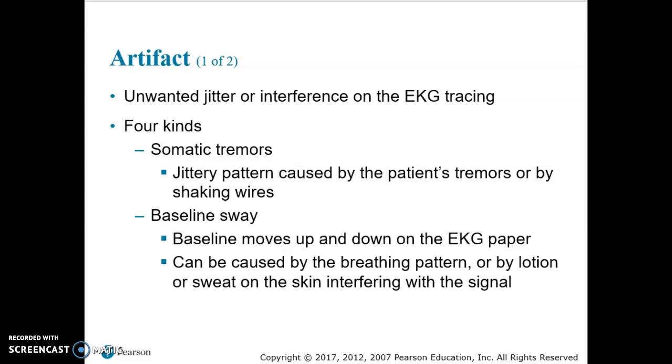You need to always follow the visible QRS waves, check the patient, check the wires, check the patches. If the patient is responsive, you don't want to immediately go into defibrillation. You need to troubleshoot and check. If that patient's walking and talking and they seem to be fine, but you're looking at something that you think may be a critical rhythm that we're going to get into later, start troubleshooting.